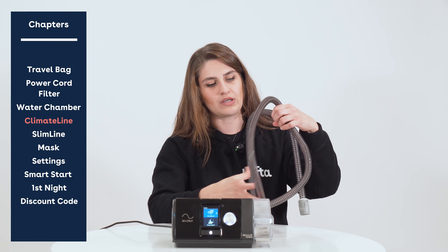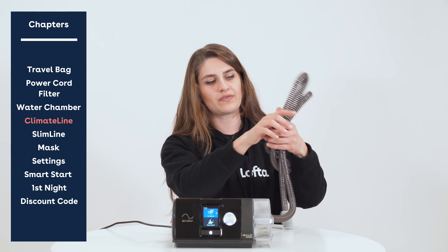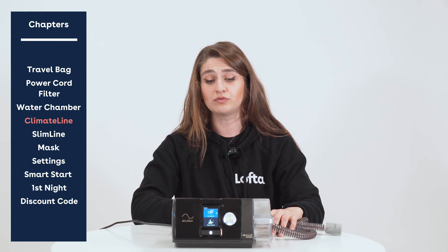The climate line heated tubing is a good option if you like to sleep in a cool room — which we recommend for sleep hygiene. In the event that you get any water buildup, which we call rain out, inside your mask or tubing, the heated tubing option lets you adjust the tubing temperature in your menus to get rid of that water buildup. For more on rain out, check out the linked video where I go over all the ways to prevent it.